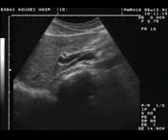The portal vein is normally 15 millimeters in diameter, the superior bile duct 8 millimeters, and the inferior bile duct 9 millimeters. If the diameters exceed these values, dilatation is suspected.